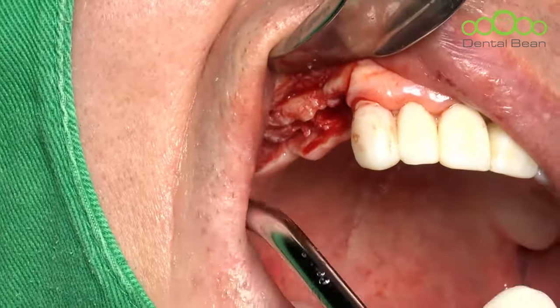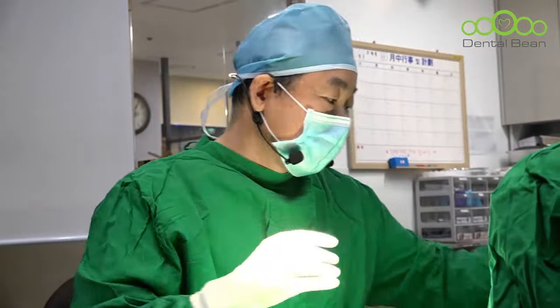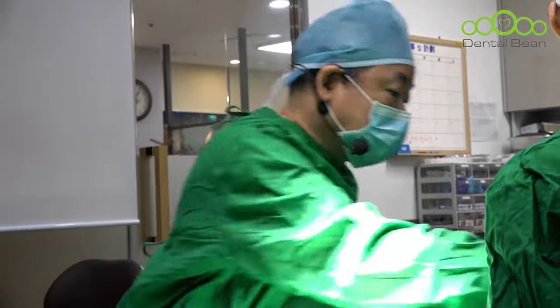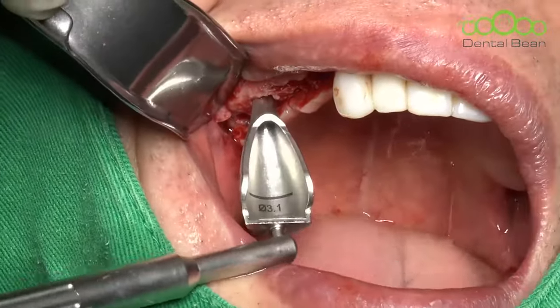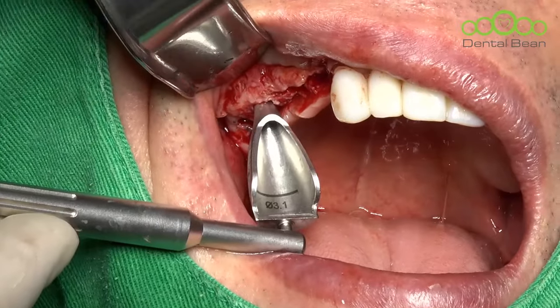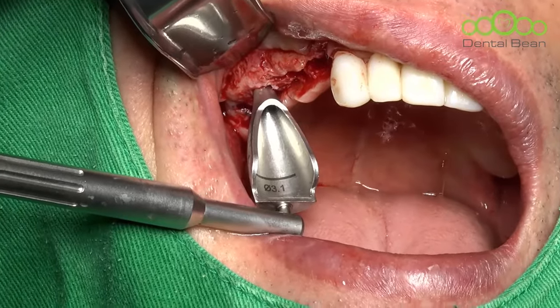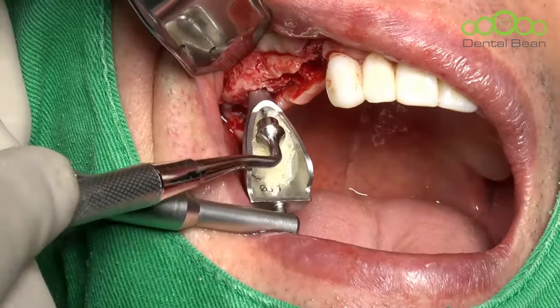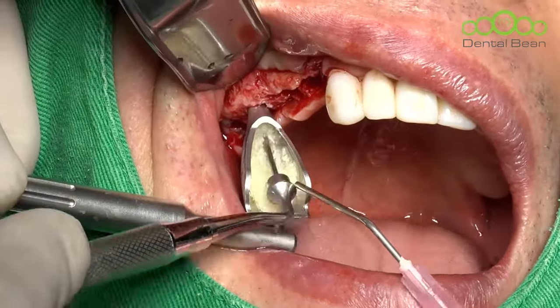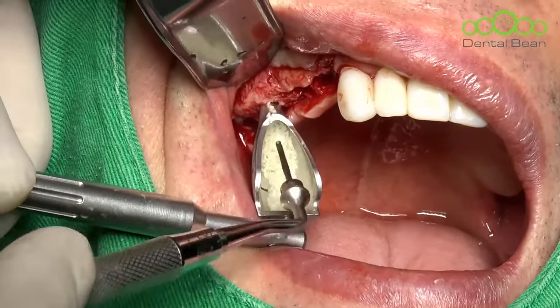Okay, done. Then I will graft some material into the sinus, because the patient has just 5 mm bone and a wide sinus. Here is a very nice bone grafting tool. We can simply engage this one. Then on the right side, I will use allogenic graft material, freeze dried bone allogenic graft material, with saline. Very simply, we can graft bone into the sinus. This is a very convenient tool.